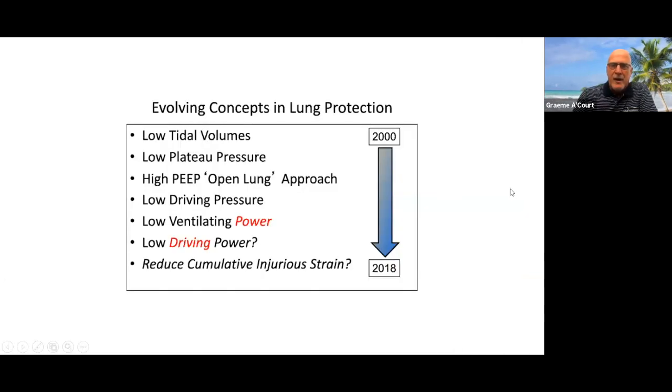Okay, so basically, I want to use this as my last slide. Like I mentioned before, I'm going to run out of time, but just looking at really going back to volume ventilation, you can see it's a lot more than just setting tidal volume or having flow. I think there's a lot of stuff, with lots of tweaks that we could do with it if we understand it. I do think I-time is important. If you're using it as an assist controlled breath as opposed to a paralyzed patient's controlled breath, like Steve said, it's a very different approach.